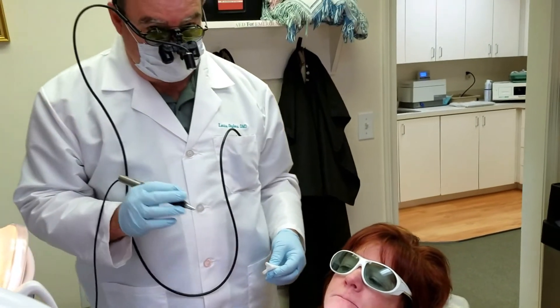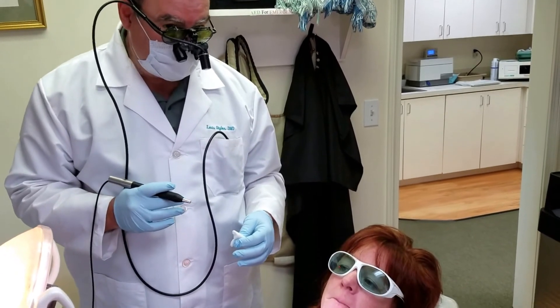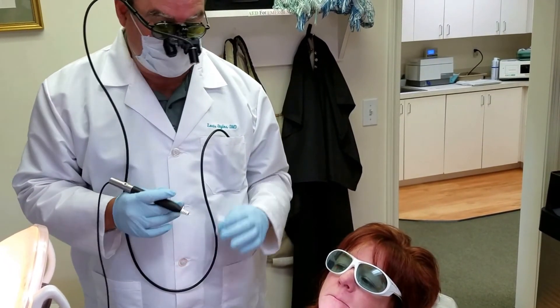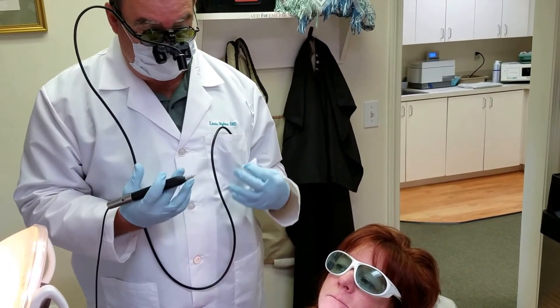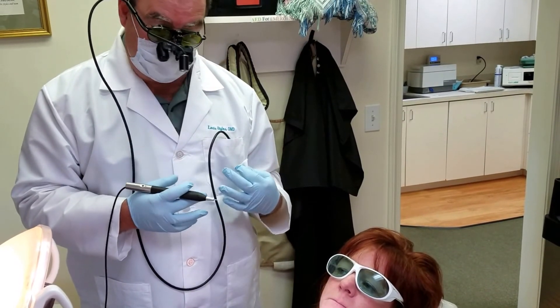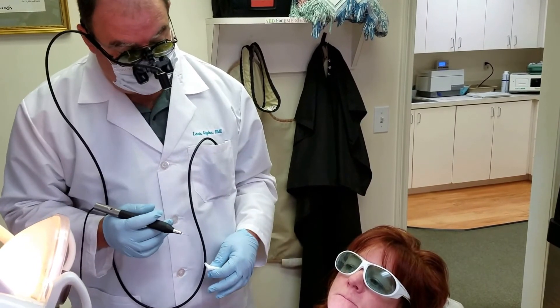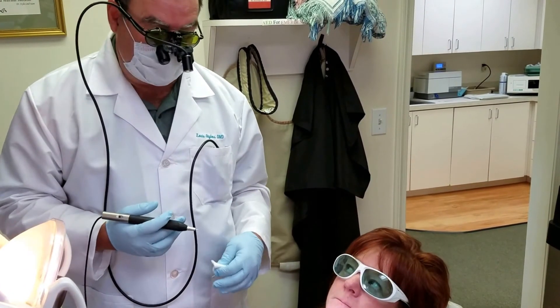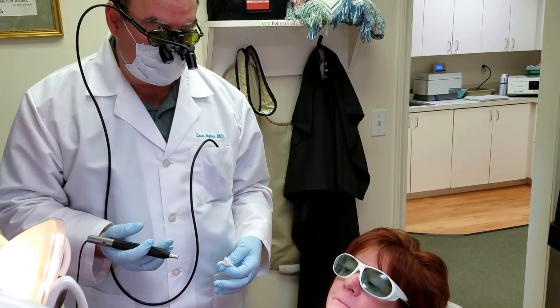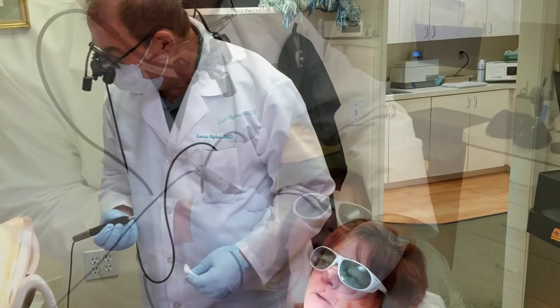So now we're going to do it one more time. Basically for 30 seconds we isolate the area, hit it with this light, give it a little breathing room because we want the healthy tissues to be okay. We don't want to sit there too long. So we're going to do another round and see how she feels. It already feels like the stinging is better. It is better.